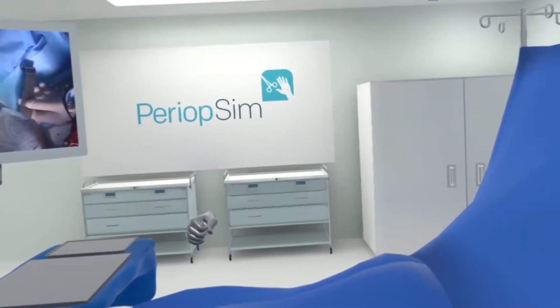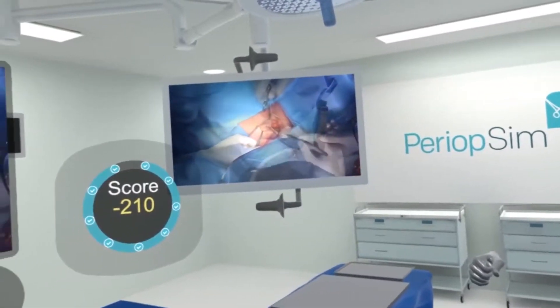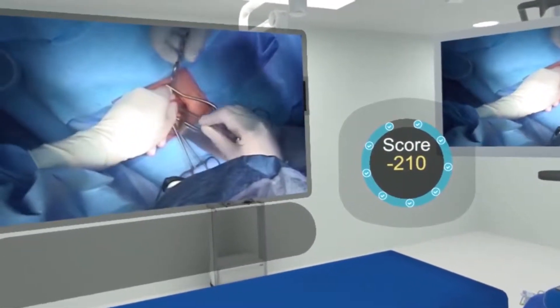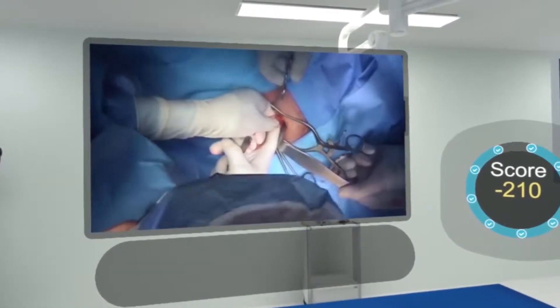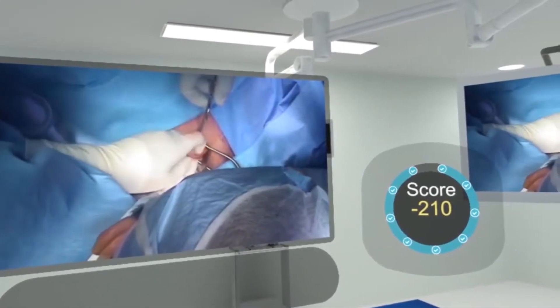Identifying the Cooper's ligament. This was just a short preview — the full version is available for group licensing. Please have your nurse educator contact us for more details.